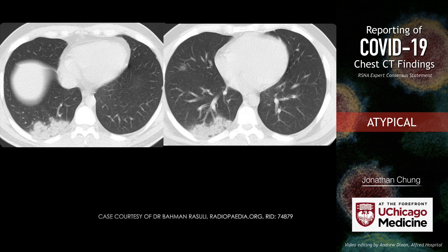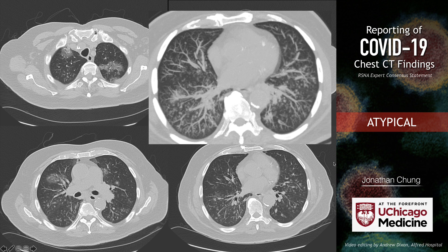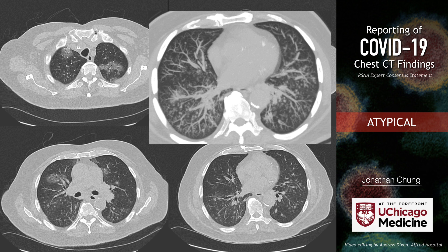Here's another patient from my clinic. At the apices we see some ground glass opacity, kind of round in morphology — when I first saw this I thought it could be COVID-19. But as we get lower into the lungs, the main finding is the centrilobular nodules. On the MIP, we see that it is indeed centrilobular, with almost complete subpleural sparing. Some areas represent tree-in-bud nodules — this branching morphology implying debris, pus, or fluid in the airways. This tree-in-bud centrilobular pattern is highly unusual in COVID-19. We dictated this as having an atypical imaging appearance, and the patient ended up having parainfluenza.